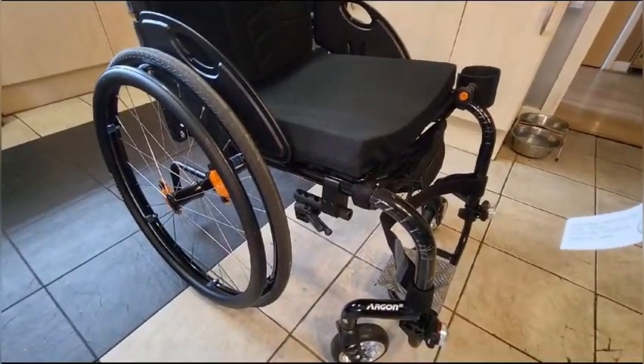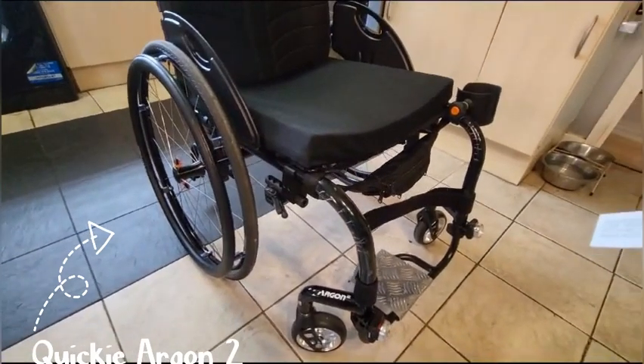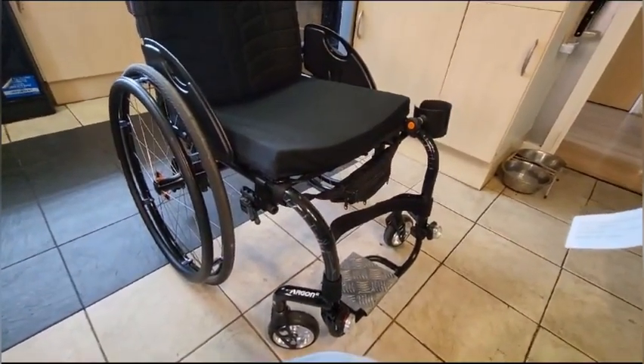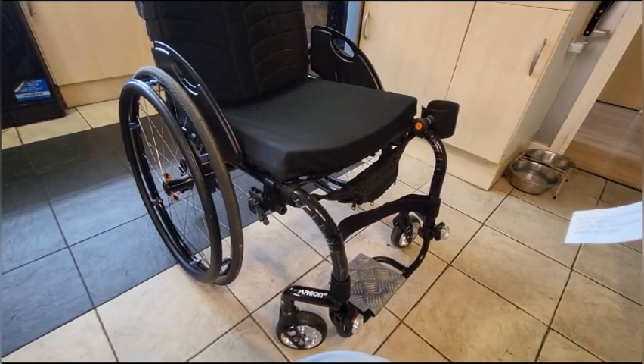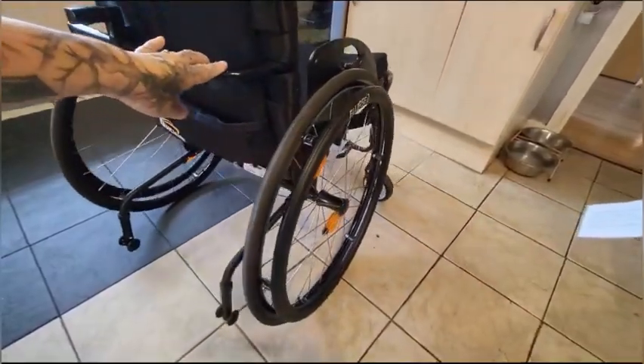Now I have the Quickie Argon 2 and I've had it a few days now. It's difficult compared to what I've been used to — with the electric one indoors you always have one hand free, and with a manual one that's not the case. I'm starting to realise that, but I still love it. It's really cool. This is the Quickie Argon 2 — it's a rigid frame, made from aluminium alloy, and it weighs eight kilograms. I've had it a couple of days now and I'm loving it.